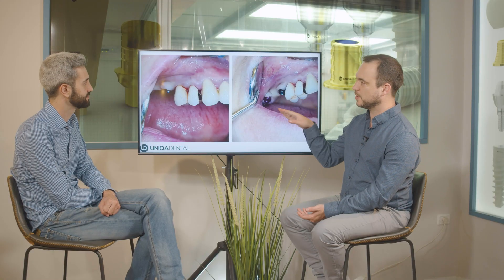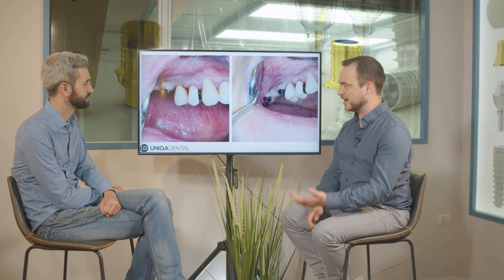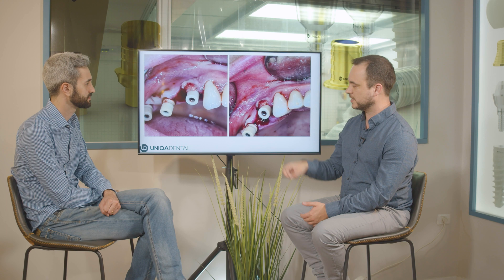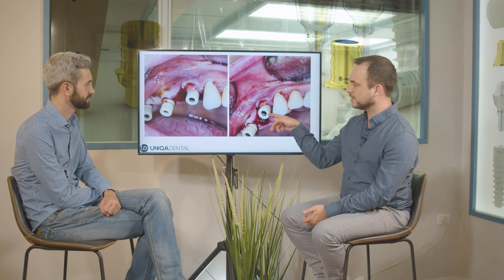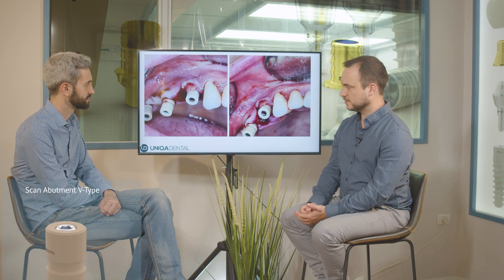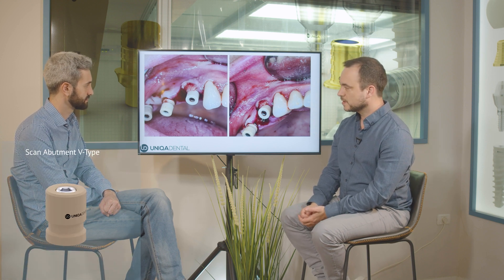Healing first and then drilling after. However, you can place near the inflamed part, so at the moment of the extraction you can place the implant. Here you can see the socket of the extracted tooth and we have the implant approximately adjacent to this socket. You can see here three multi-unit abutments — three of them are for angled multi-units.